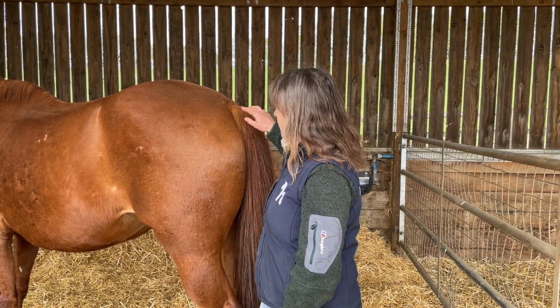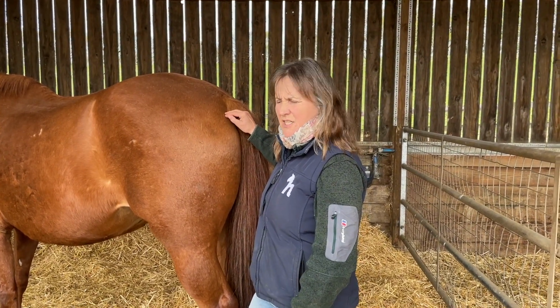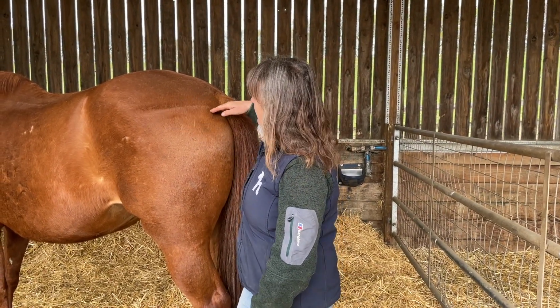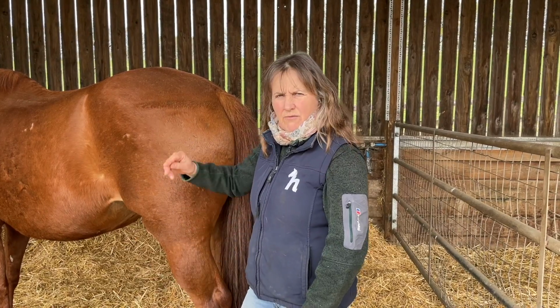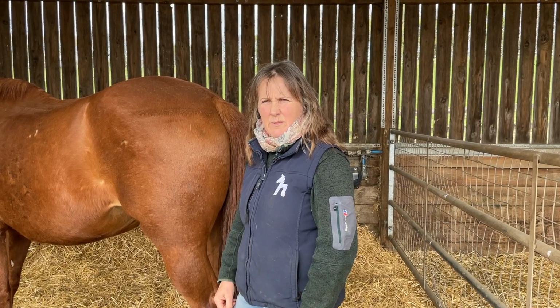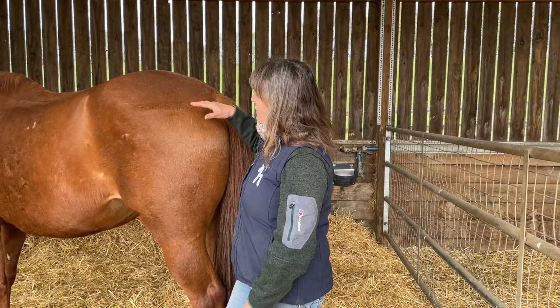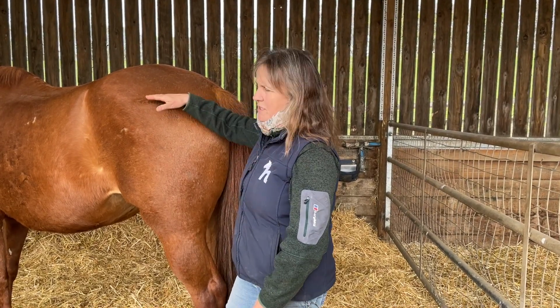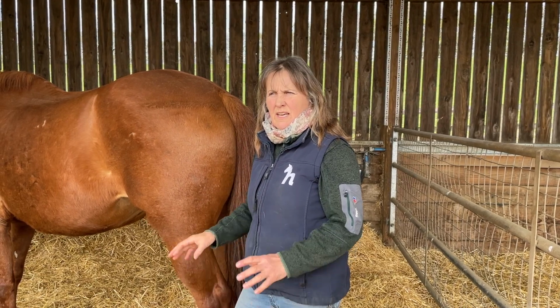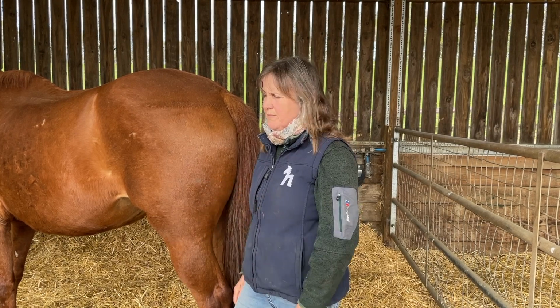Obviously the exit to her digestive tract is right here under her tail, and then the rectum, think of it as running parallel to the floor, if you like. It varies amongst horses, and the older they get, things get a little bit saggy. It's inevitable with all of us, but think of that tube that is the end of her digestive tract as running parallel to the ground, and then you'll not go far wrong as you insert. Because I think a lot of people get frightened of actually the inserting part of the thermometer.